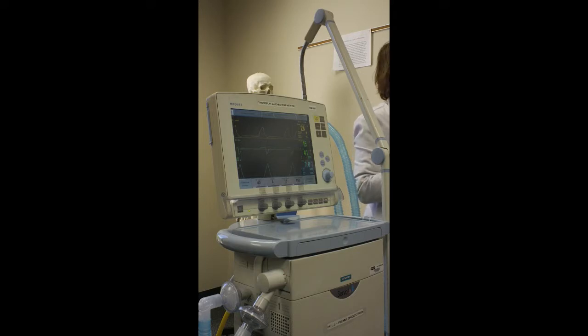What did it say on ours? Ramp? Ramps, yeah, same thing. What was the other one? The rise time is also, square and ramp? Square, no, that's your flow waveform. Ramp is sometimes called a rise time though. It's how quickly it's going to ramp up to that pressure. Okay. Square would be the flow pattern though. I thought us changing it delivered it gradually rather than all at once.